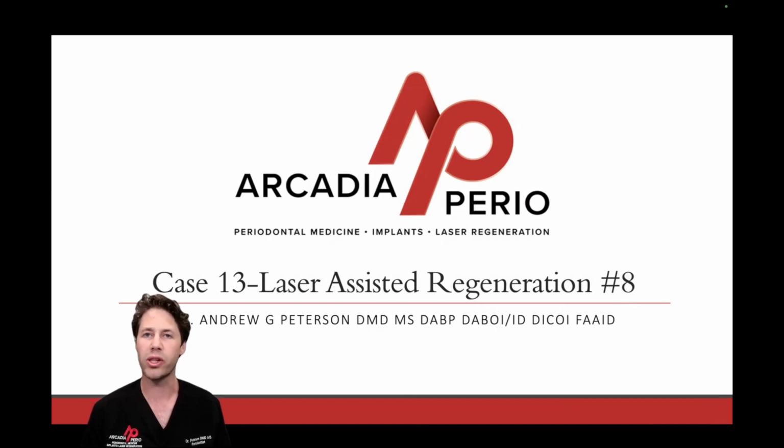What if I told you there was another treatment modality that would lead to better aesthetic results, minimal discomfort to the patient, and better long-term bone predictability in terms of bone growth and bone regeneration? Well, there is. Come join me with this case as I walk you through the treatment that we chose to manage this periodontal defect in the anterior aesthetic zone.